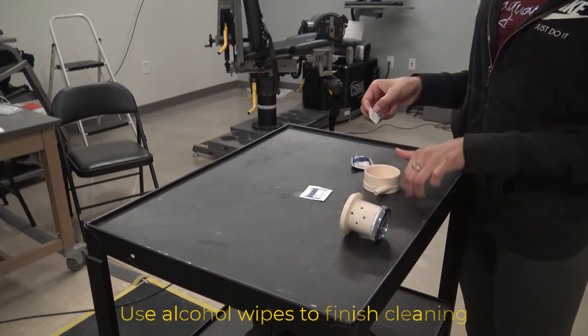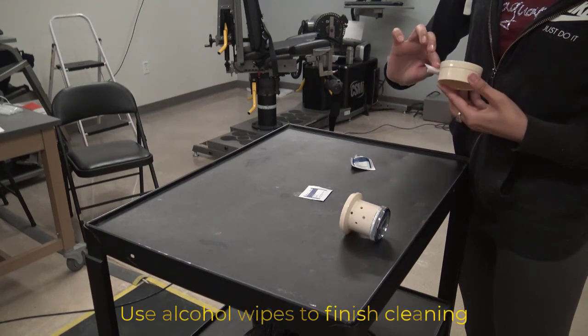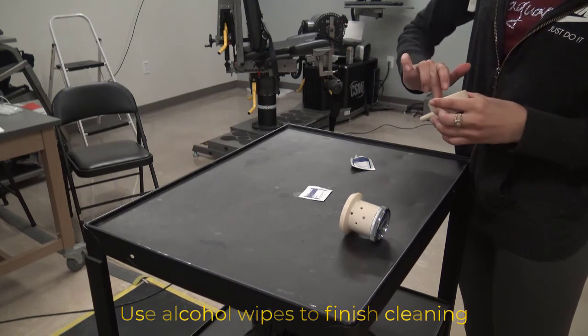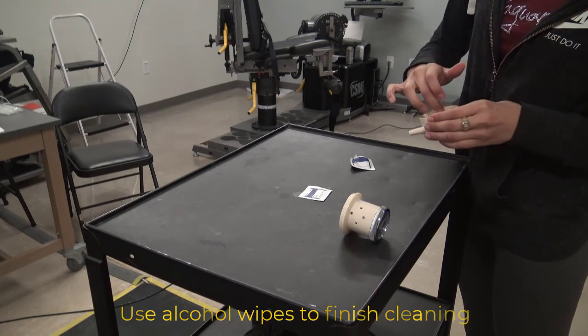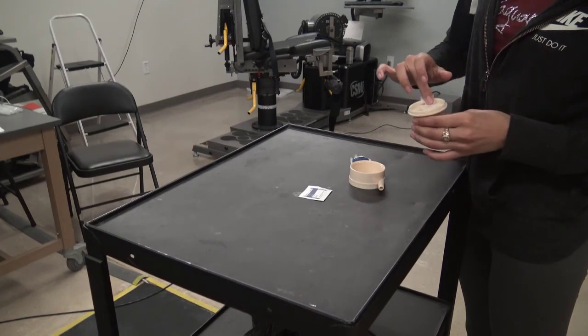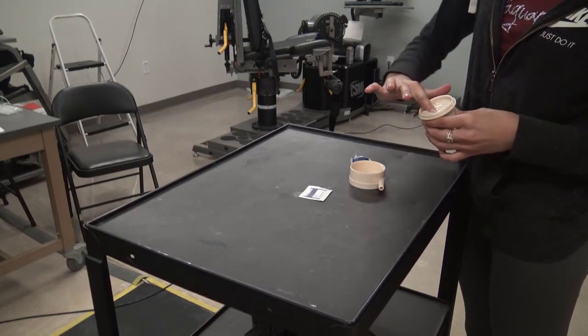While we'll clean both the inside and the outside of the spirometer, it's always good practice, even though we clean it after, that whoever will be using it next should clean it as well, just in case. Once it's cleaned, we can set it aside to air dry if it needs to be, and then it's ready for the next use.